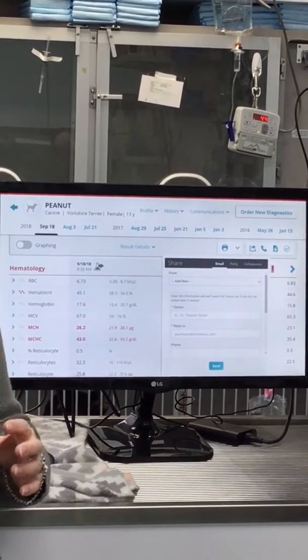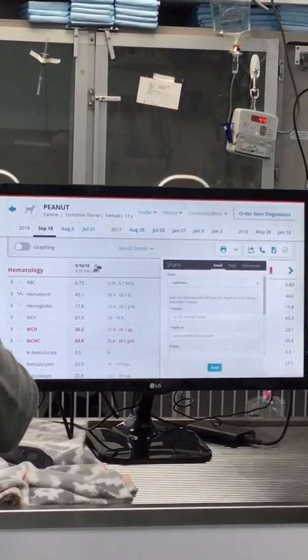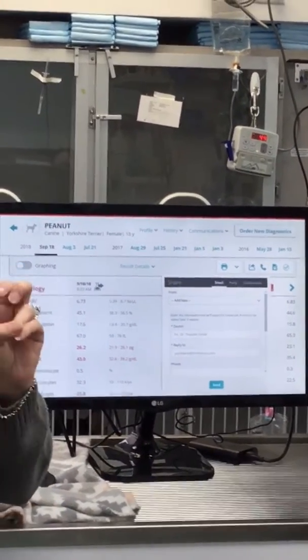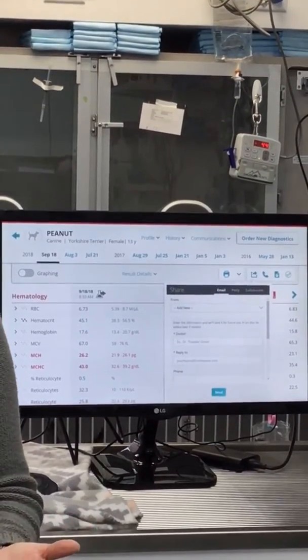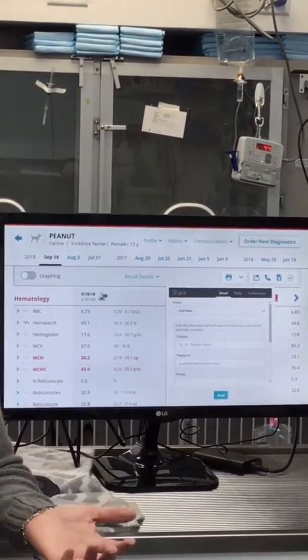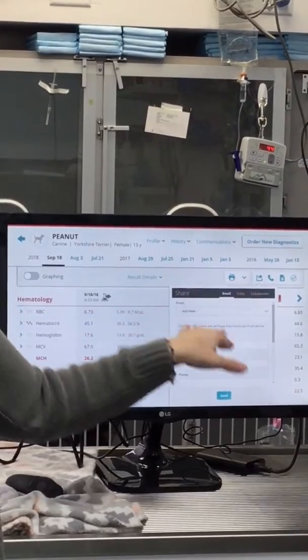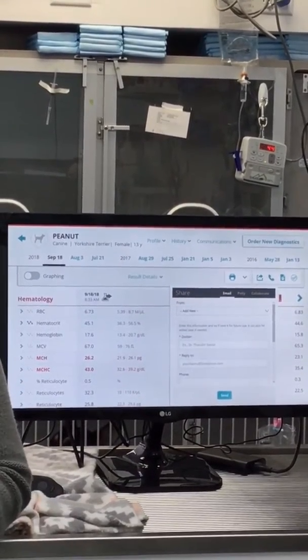So if you think about what Facebook is, you know how you get a friend request and then you see that timeline. So with collaboration, you can actually share that patient with another hospital. So this would be good for, let's say, your chemo patients, if they're going back and forth and you're going to see them quite a bit. So what happens is you're going to select collaborate and put in the respective email of whoever that hospital is.